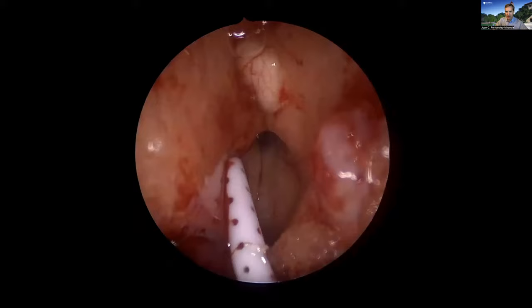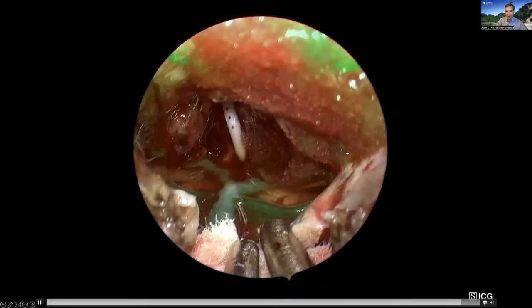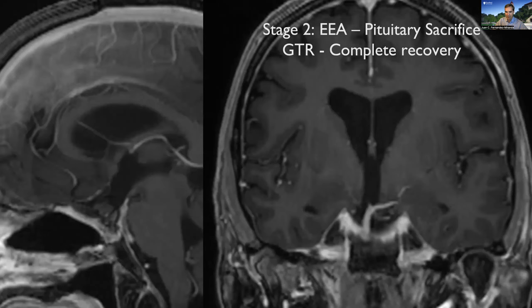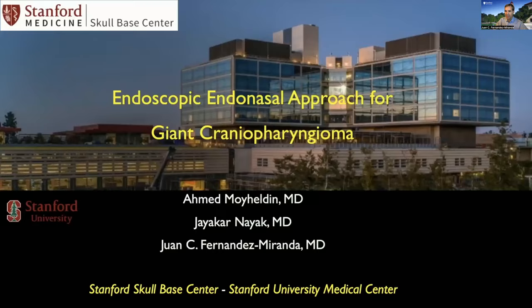With ICG visualization, you can see the hypothalamus bilaterally nicely preserved. You can see the indentation that the tumor caused, but we performed a good accurate resection of this tumor, and this patient has an intact hypothalamus. Of course, the patient needed full pituitary replacement, but had excellent recovery of cognition and no hypothalamic complications.